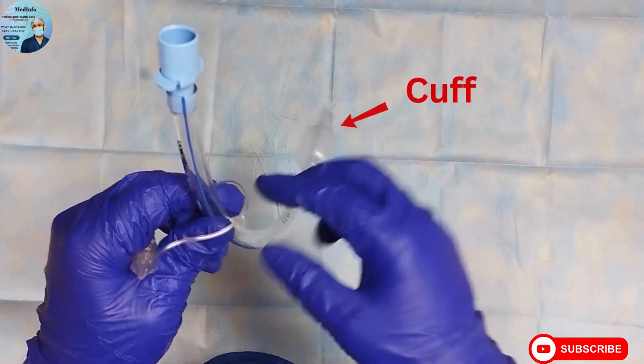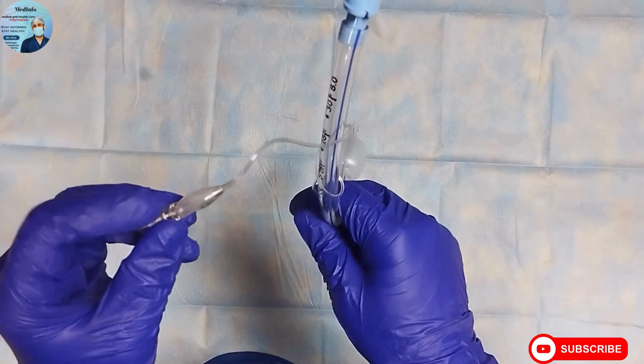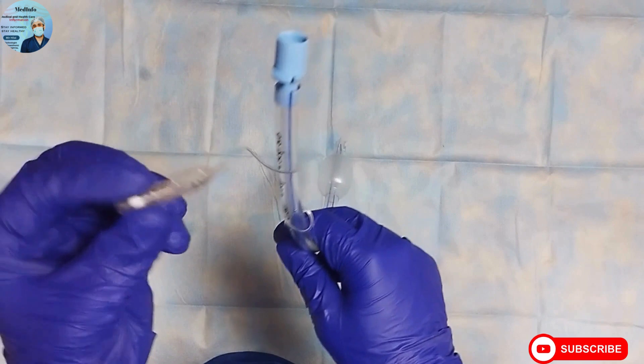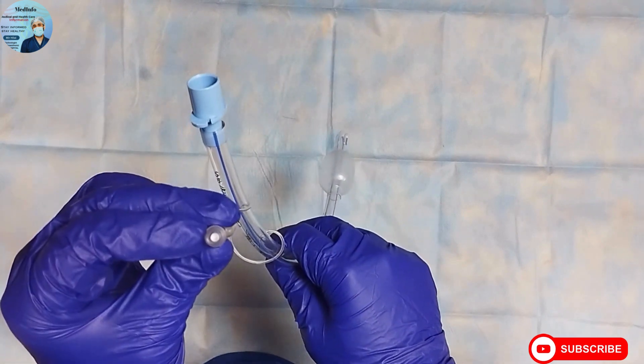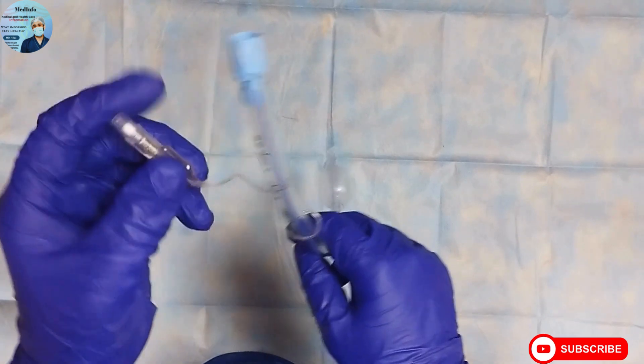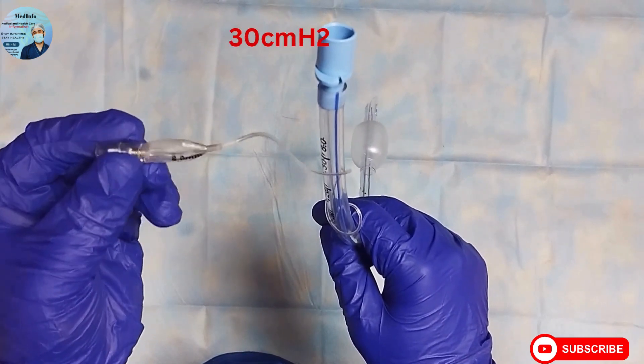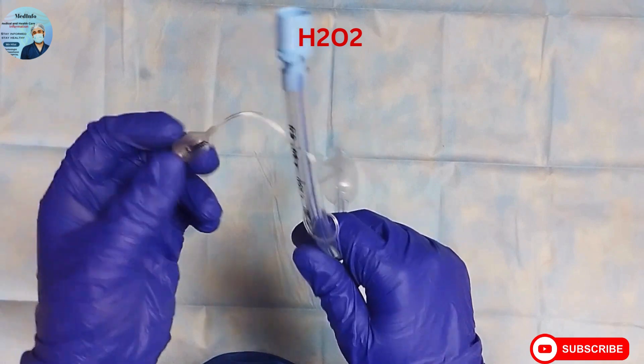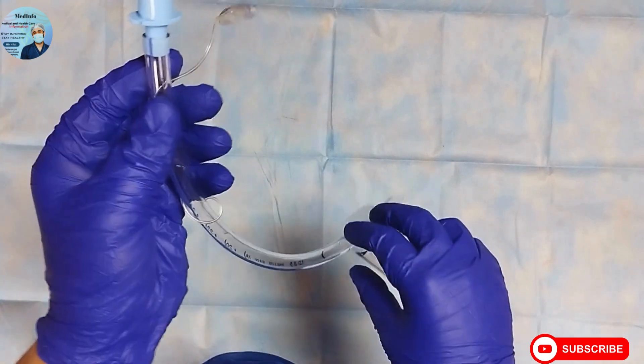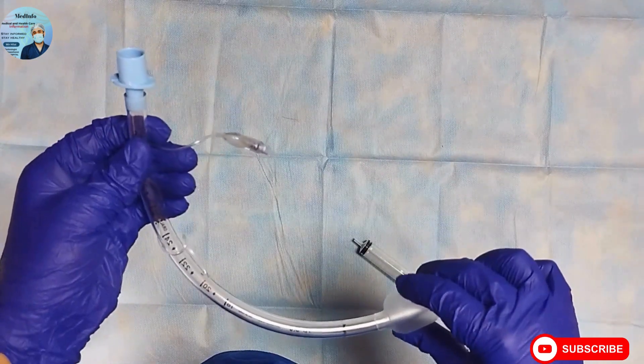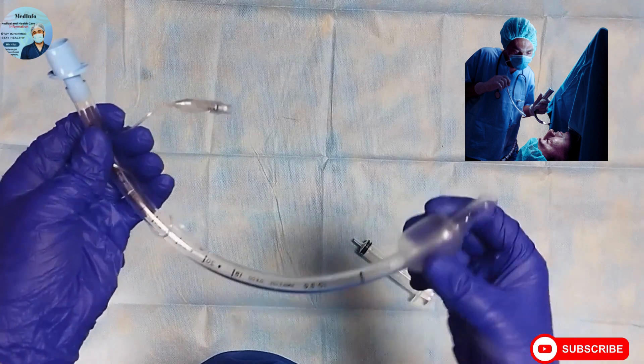Usually 4 to 8ml of air is required to fill the cuff. During cuff inflation, we always need to ensure the cuff pressure to be less than 30 centimeters of water to prevent tracheal ischemia, which can be caused due to high pressure inside the cuff.